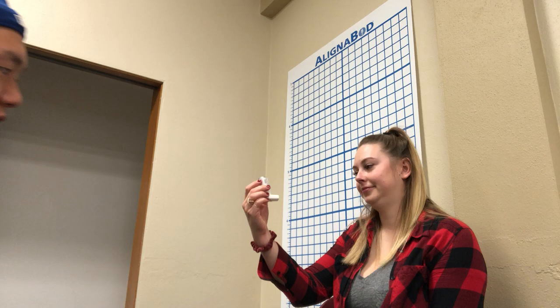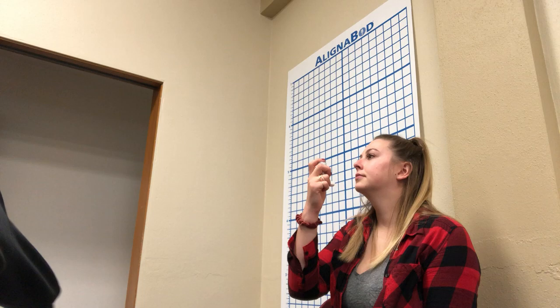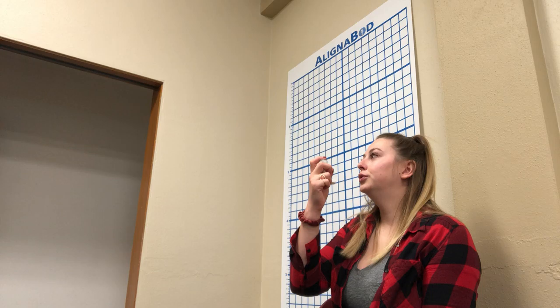Hold the inhaler upright with the mouthpiece at the bottom, facing that way. Then tilt your head back slightly. I'm going to have her breathe out slowly and completely.